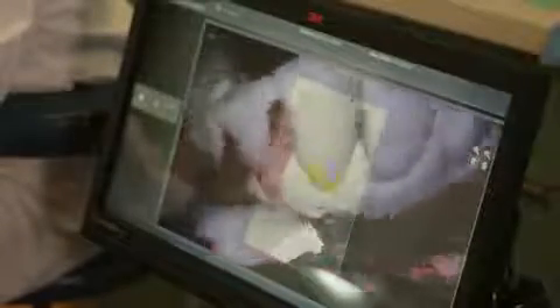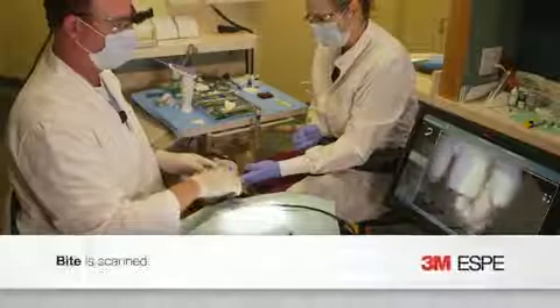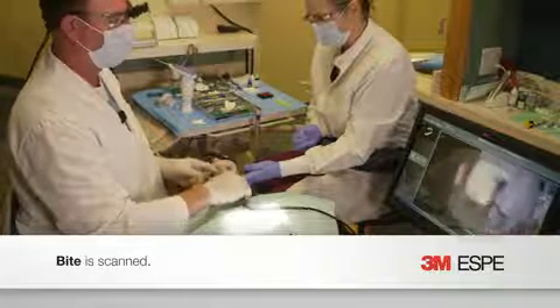Whenever I'm doing opposing arches, I'm usually a little quicker because I'm not worried about prep margins — I'm mostly getting occlusal anatomy. You can see that just took 10 seconds, and we'll do a couple of bite registrations just to make sure we're happy with what we've got.